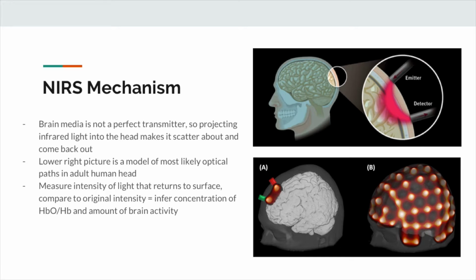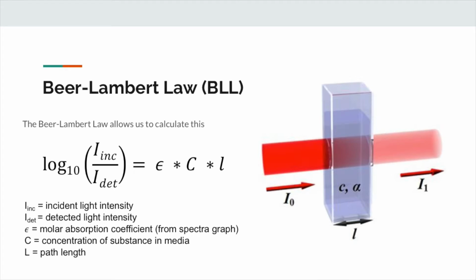Now, to know how to do that comparison, it's time for some math. This is kind of the big physical law that we follow. Yes? Quick question. So one electrode is either a detector or an emitter, right? Yes. So you don't have both in the same location. Correct. You can build a system, and I believe some systems exist where one wire will contain both, but that's because you have separate optical feeds going into this one head. Right. And you still need space between whatever the source is and the detector is, because you need to measure something in between them.